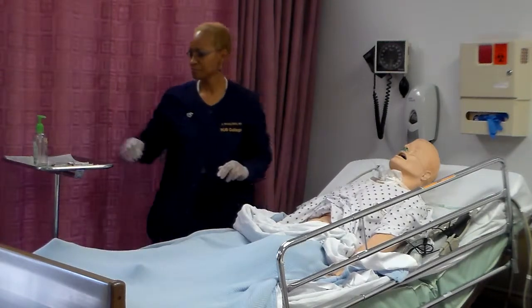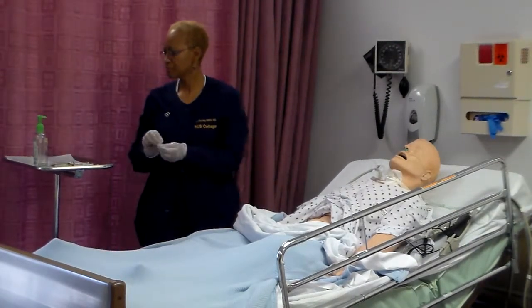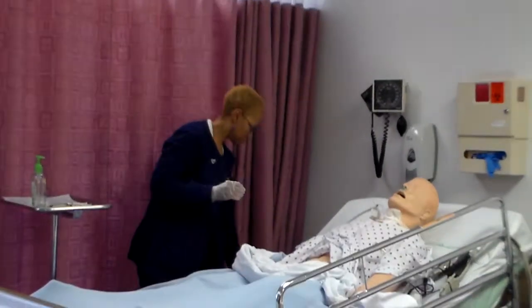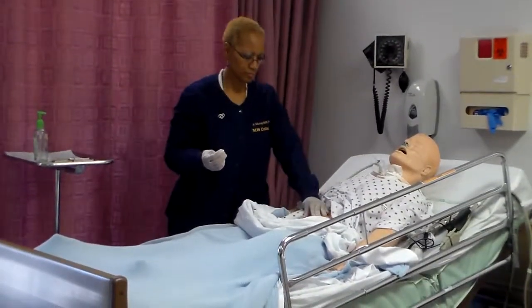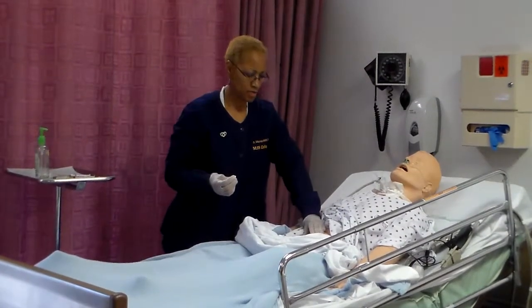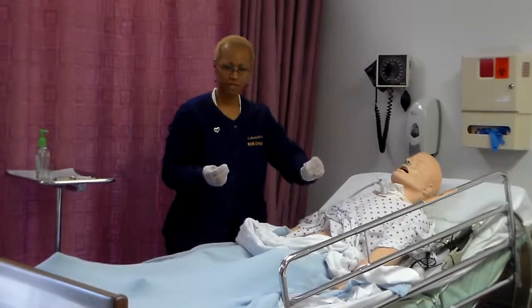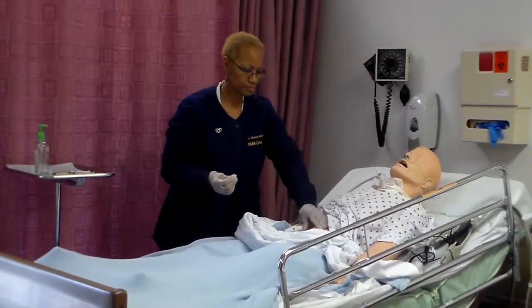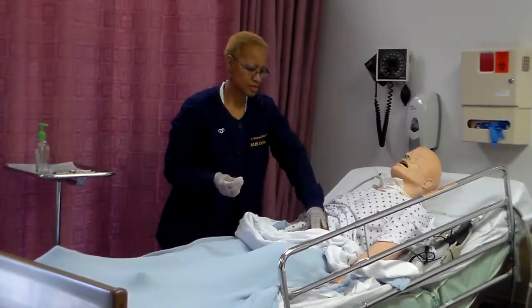Be sure needle is correct size by grasping skin fold at site with thumb and forefinger. Measure fold from top to bottom. Needle should be 1/2 length. Okay. You're going to pinch it in between your finger. He doesn't pinch very well. Okay.